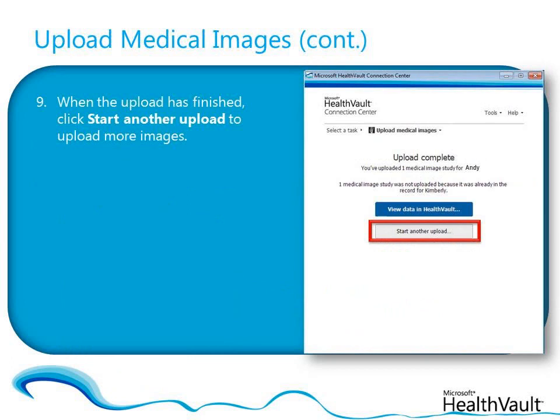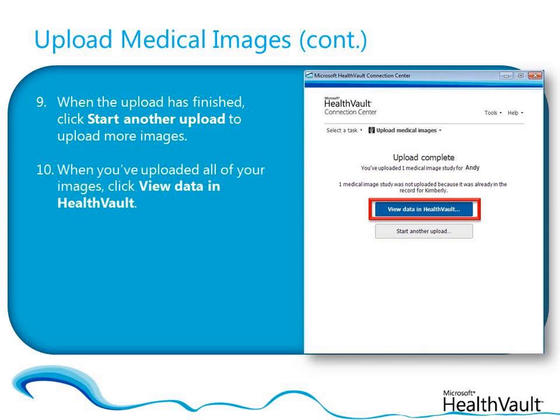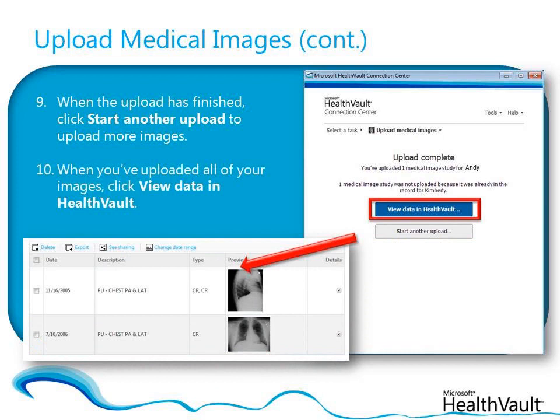When you've uploaded all the images that you want, click View Data in HealthVault to open the Medical Image Study Details page in your HealthVault account.